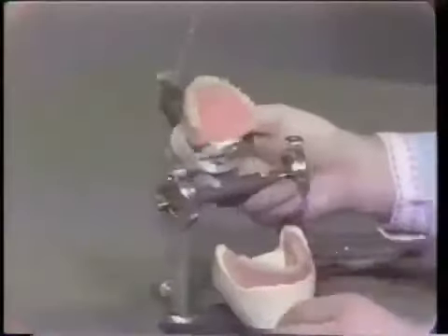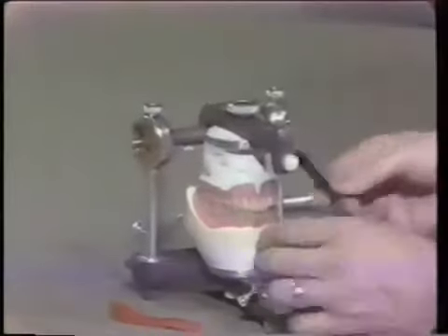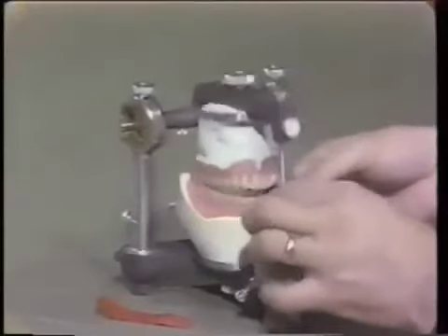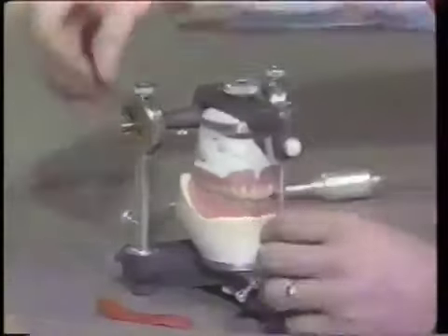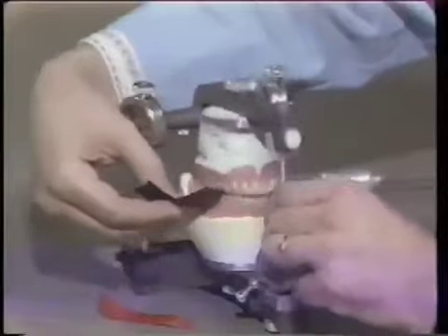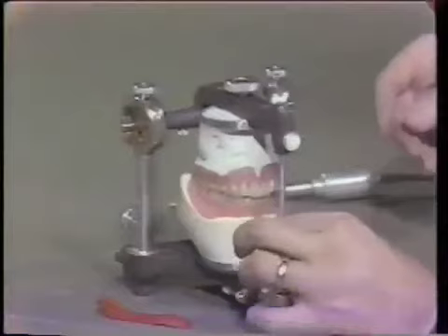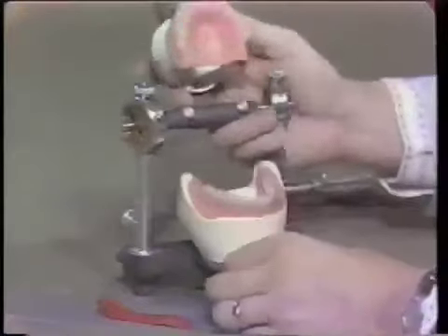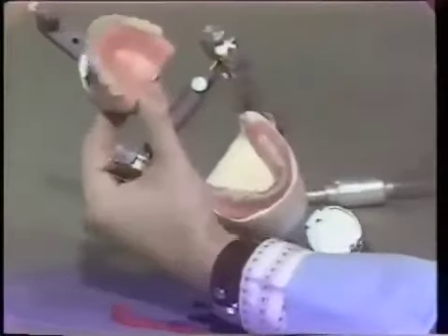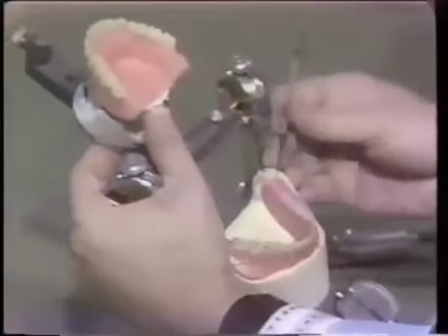Now I've ground a couple of areas. I'm going to go back to the articulating paper, and it should begin to feel more solid. Initially as the dentures come together, the occlusal surfaces will feel a little mushy or there will be a slight slide — it doesn't feel solid. It's a tactile thing you can pick up by just tapping the teeth lightly together. It feels a little more solid just after a couple of adjustments. Once again we examine the occlusion and decide whether to remove parts of the teeth.